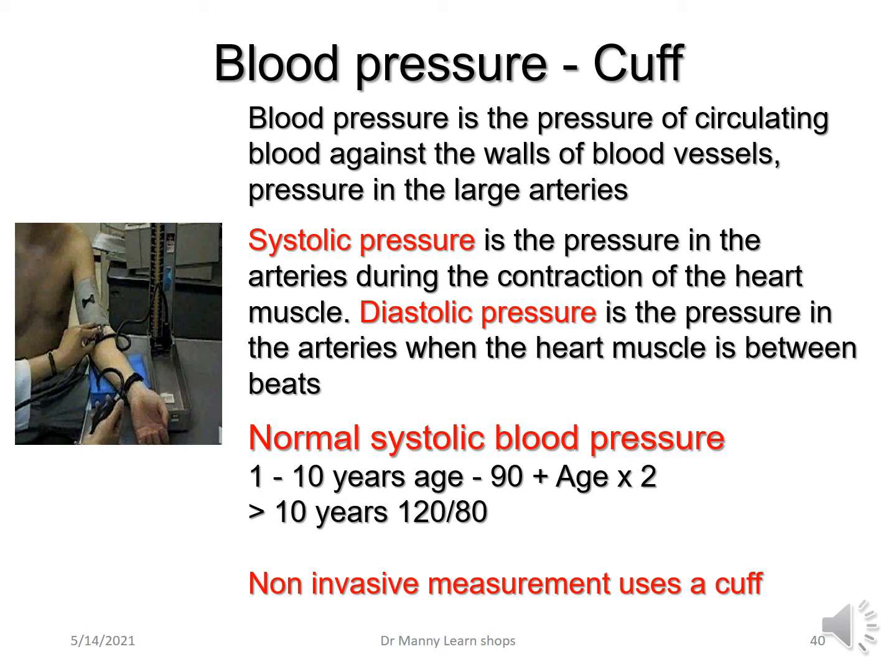A non-invasive measurement for blood pressure uses a cuff. Make sure that the cuff is the correct size and placed correctly on the limb. Otherwise, you may get erroneous readings.